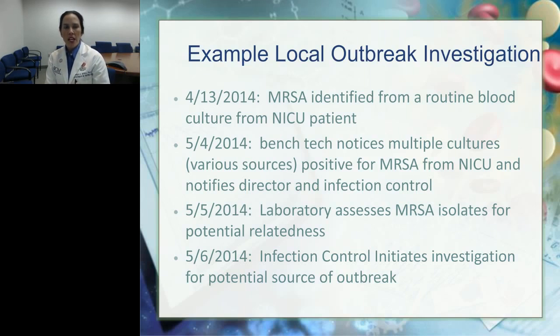But in early May, we had one of our bench techs, and this emphasizes that this is not just a one-man game. It's really a team game, and in many of these investigations that you'll hear about today, the first person to be that canary in the coal mine was just a bench tech who happened to be paying close attention and said, hey, I feel like I've noticed more MRSA isolates lately. And so that word led to myself as a director doing a little bit deeper investigation and notifying our infection control. And indeed, we did assess that we had an increase in our number of MRSA isolates.